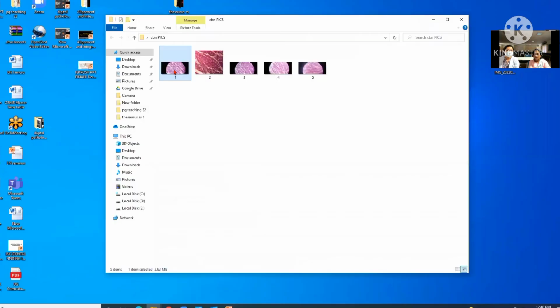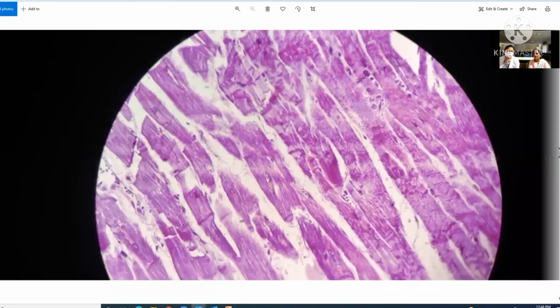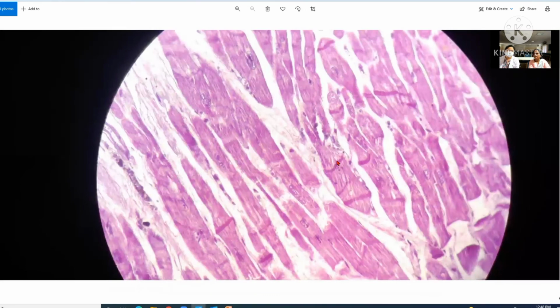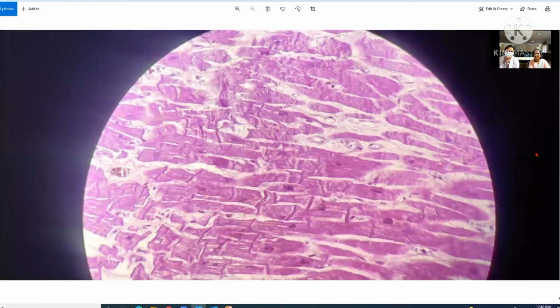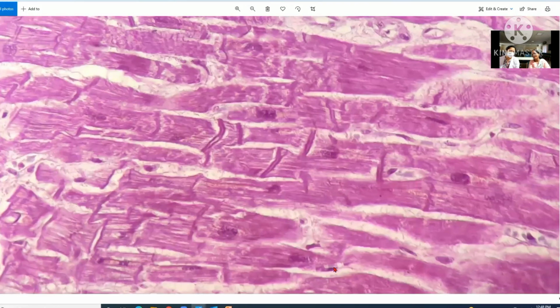Yes, shown. So now we have read about the description of it. See, there's the contraction band necrosis. I hope our pictures are more clear than the article's. Beautiful. Let me zoom this. We can observe. Yes. So contraction band necrosis, just one histological finding, can give a clue to the underlying cause. So that's why we said it uncovered the histology of the cardiomyocytes.